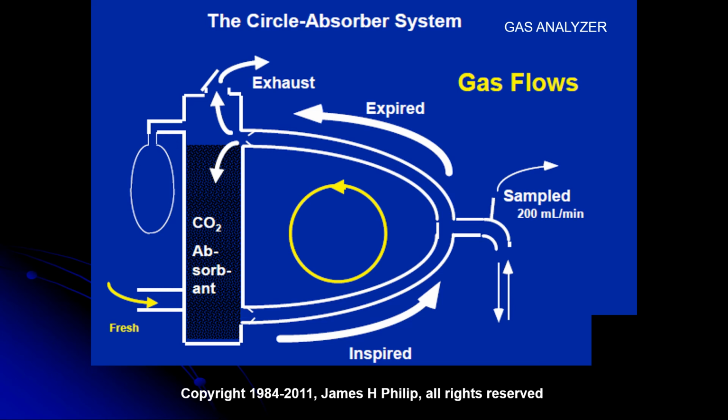Think that if we could match exactly the oxygen consumption of the patient and the leaks, inevitable leaks of the machine, the surgeon, we spoke about it, then theoretically, once the brain, let's make a small brain over here, it looks like a loaf of bread rather, but never mind, then when the brain is saturated, we could eventually turn the vaporizer off. But what we need to do in this phase, once again, once the brain is saturated, is only to compensate for the leaks.